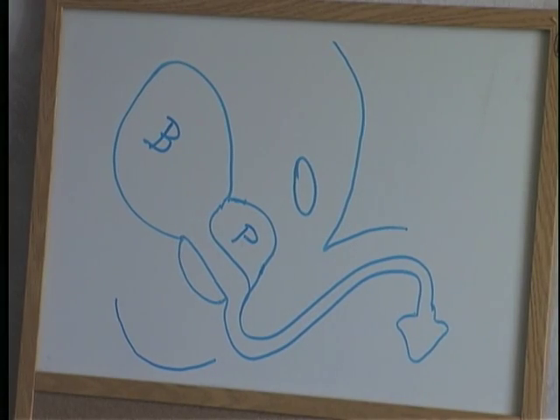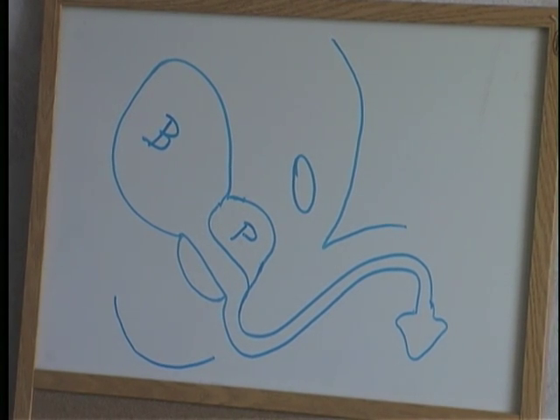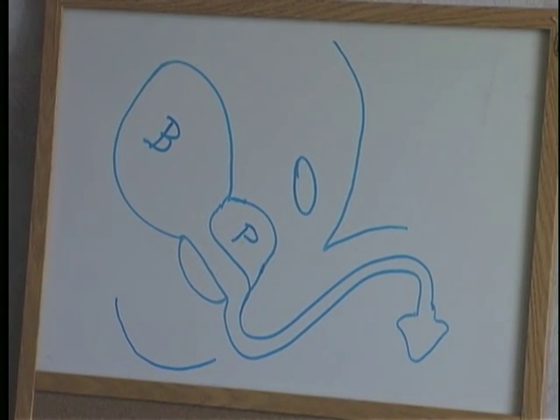We're going to take a look briefly at an anatomic depiction of the prostate, urethra, and bladder, and this will help further enhance the visualization of how a Coude catheter is inserted. In the standing position, the male urethra has an S-curve type configuration prior to insertion into the prostate gland and into the bladder.